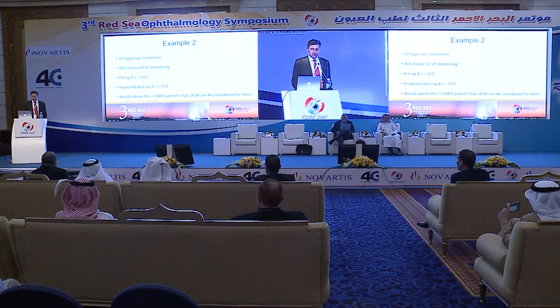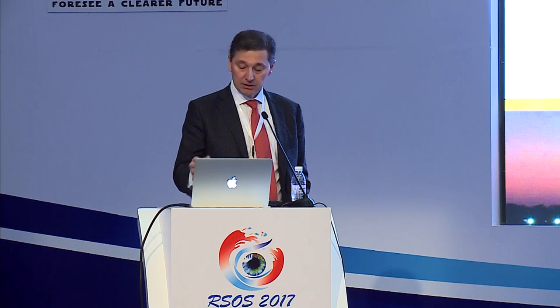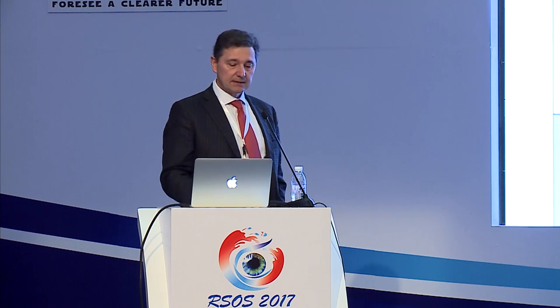Look at a patient like this who's plus 5. This is going to induce 6 diopters of steepening. Pre-op is 41, you're going to end up at 47. You know what? You can do this. If this is the only option for this patient, you can do it. It's informed consent.